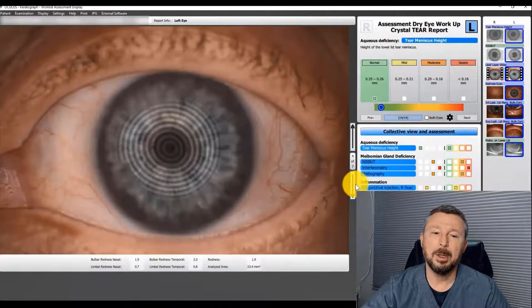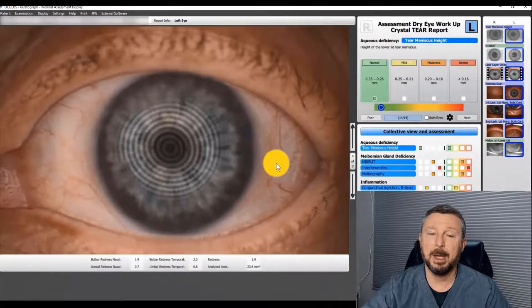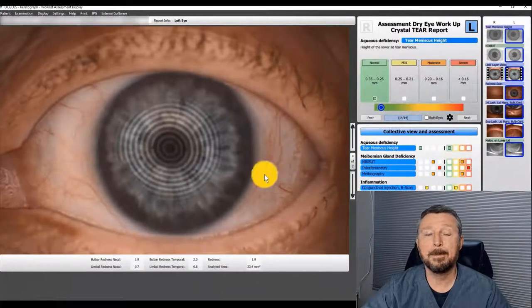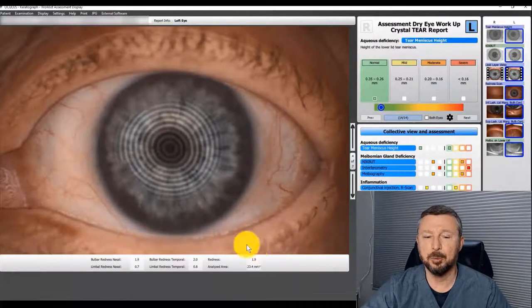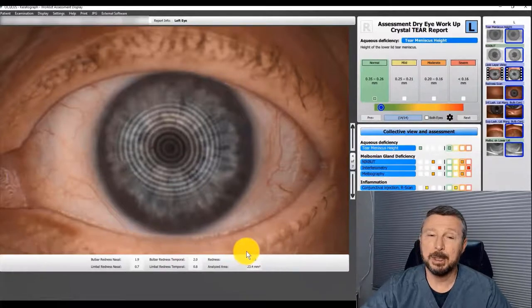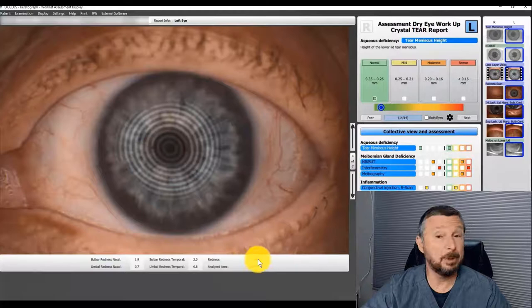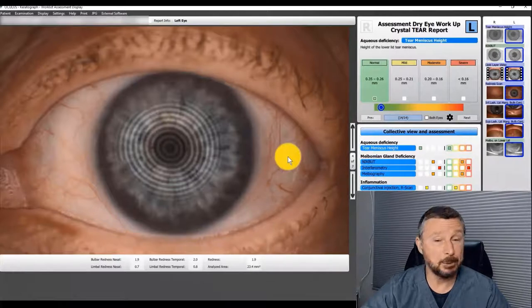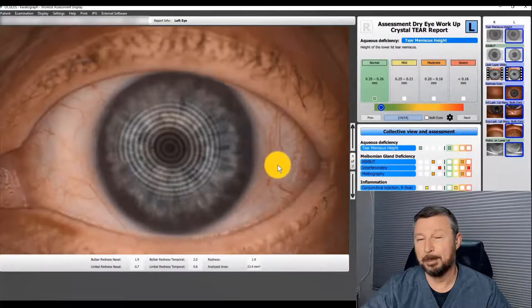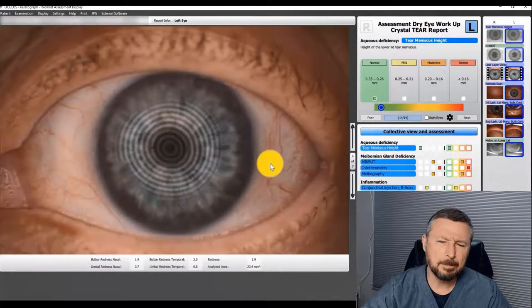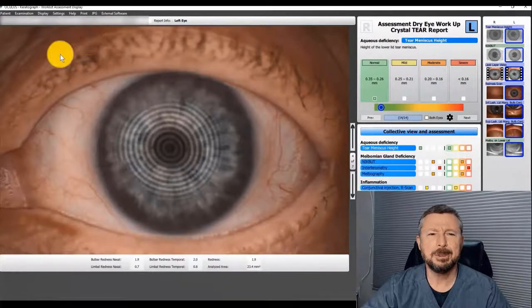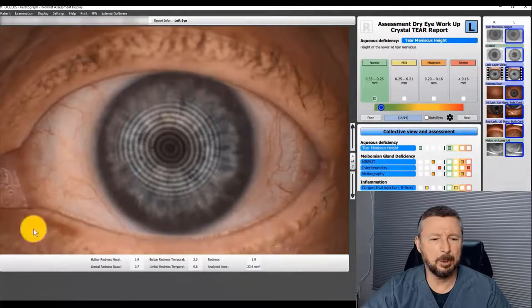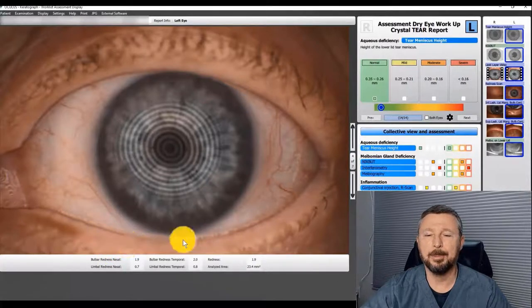Next we look at a redness score. The computer is looking at the white part of your eye and measuring how much red it sees. Redness is a measure of inflammation. Your redness score is 1.9. Normal redness is anywhere from 0 to 0.5, so you're nearly four times redder than normal. This is due to inflammation — most likely from dry eye, but it could also be from allergy or even a rough night. We can also see a yellowish discoloration along the lash line in the upper lid and a little bit in the lower lid. That is a biofilm, and we'll get a closer look at that in a moment.